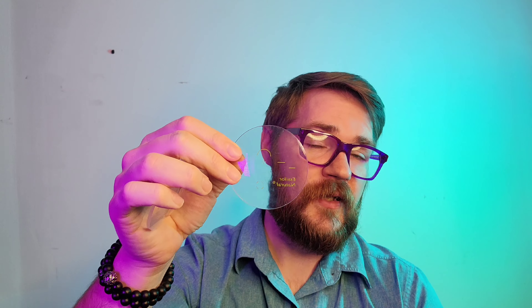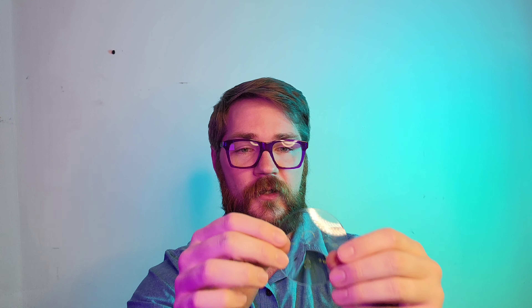With progressives, that zone pinches down. The advantage with these is it's progressive — there is no hard zone for distance and no hard specific zone for near; it gradually changes from distance to near. You've got a little bit of everything, and especially as you get into stronger powers, that does have the obvious advantage of giving you that easy arm's-length zone. The problem — and I have to pause to say problem — is there's a lot of distortion in these. That's just the nature; you have to blend the curves from the distance zone to the near zone.